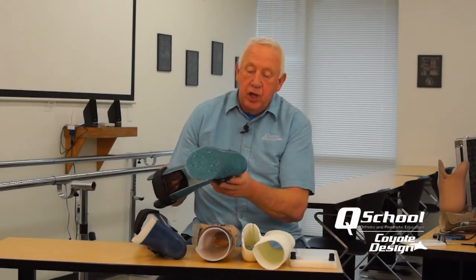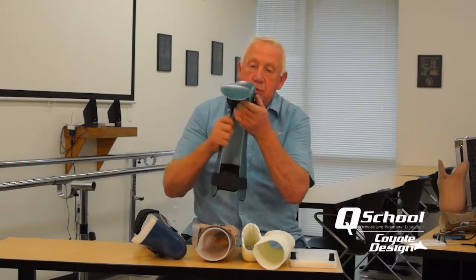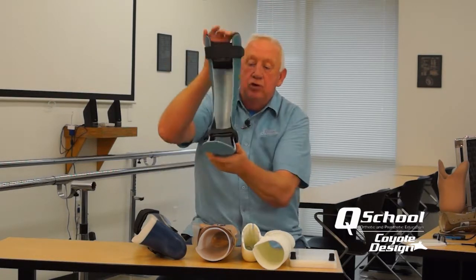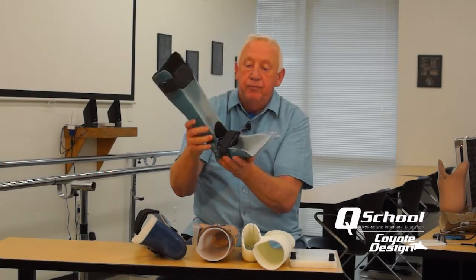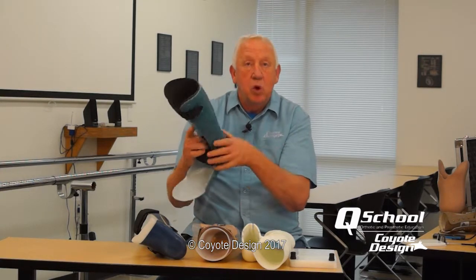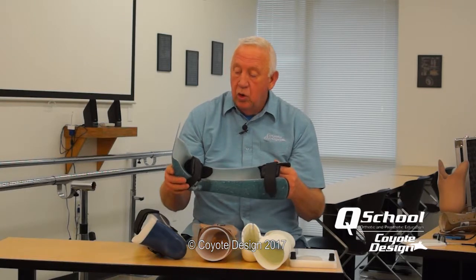Another typical design is a hinge AFO with a downstop. As you can see, there's a nice flat surface on the plantar surface, so inside the shoe there's no rocking — the patient is much more stable. We also go into the fabrication of these devices as well as some mold modification in this course. We hope you enjoy it.